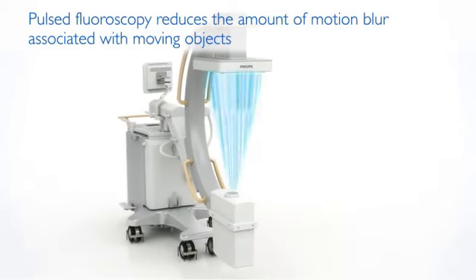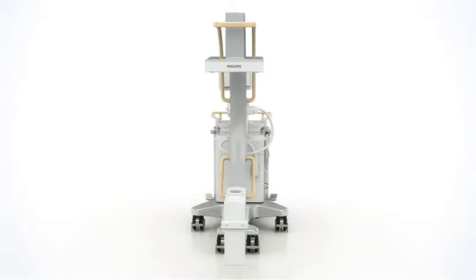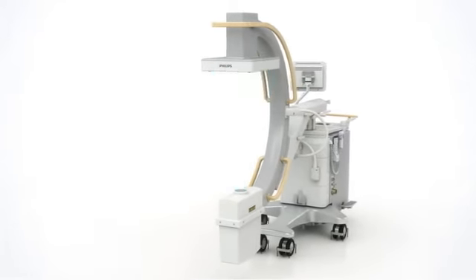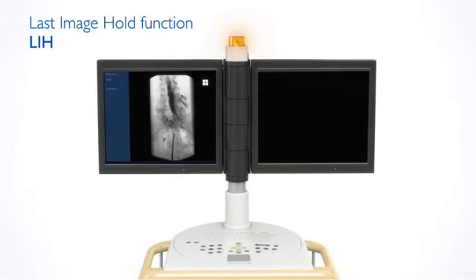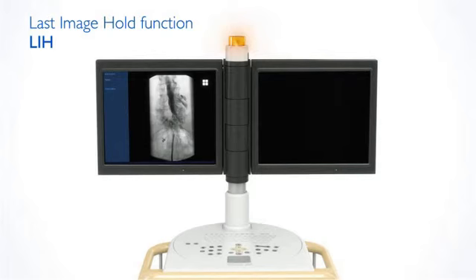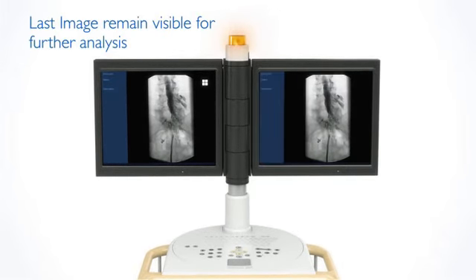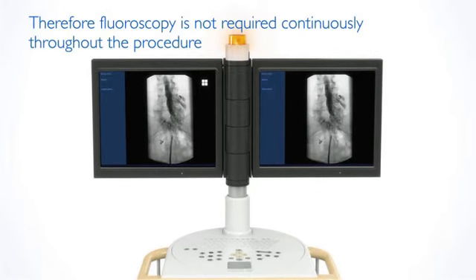Pulsed fluoroscopy reduces the amount of motion blur associated with moving objects. Lowering the pulse frequency makes it possible to reduce radiation exposure. The last image hold, or LIH function, allows the last image to remain visible for further analysis. Therefore, fluoroscopy is not required continuously throughout the procedure.